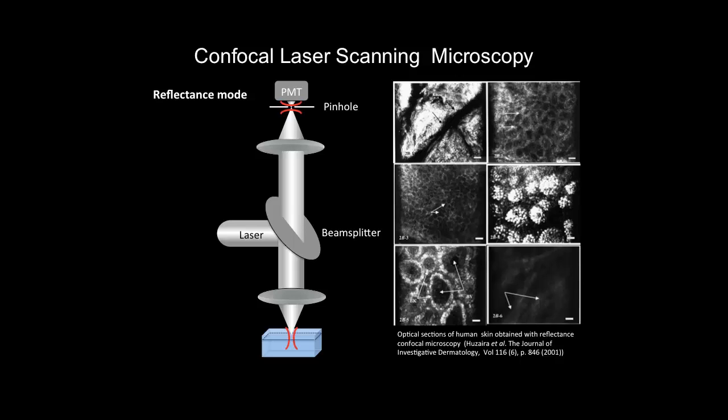We are looking at the epidermal layers, this cellular structure in the skin. These bright cells over here are pigmented cells in the skin, and then deeper here we have the dermis, the fibrillar structures. We don't see it very well in this image.